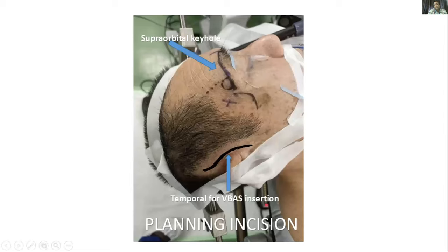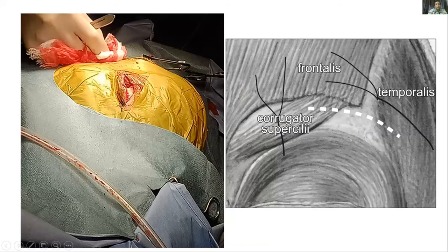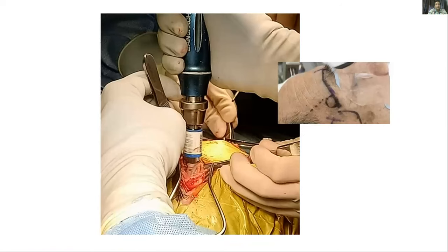We decided to use an endoscopic approach, but this tumour was so extensive that it could not be removed with a single approach. So we used an endoscopic approach through the supraorbital keyhole area as well as through the temporal area via the middle temporal gyrus using a ViewSide brain access system. The incision extended from the supraorbital notch on the right side laterally to the margin of the eyebrow. The frontalis, corrugator supercilii, and temporalis muscles were retracted, and a small burr hole was made at the keyhole area with a craniotomy of approximately 3 x 1 cm.